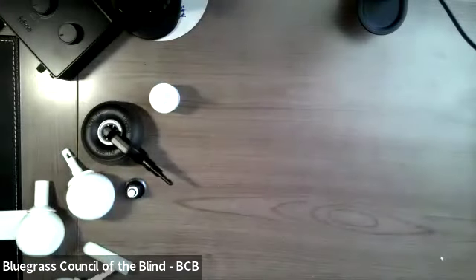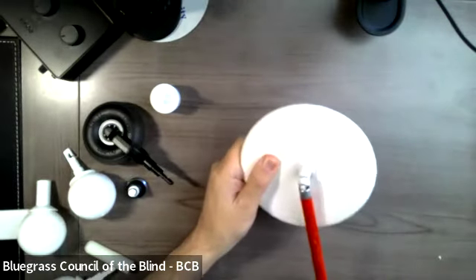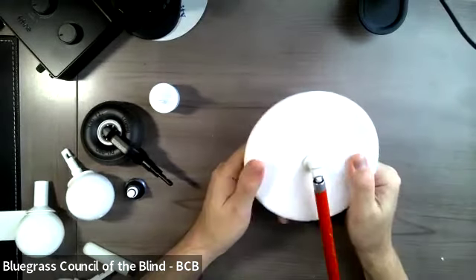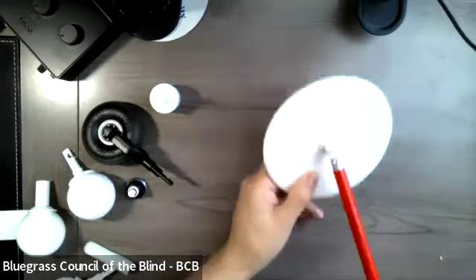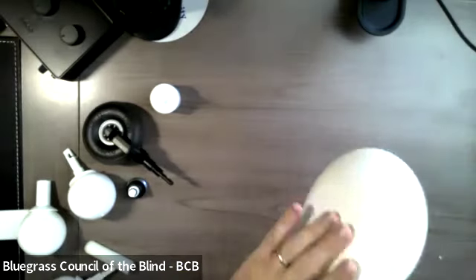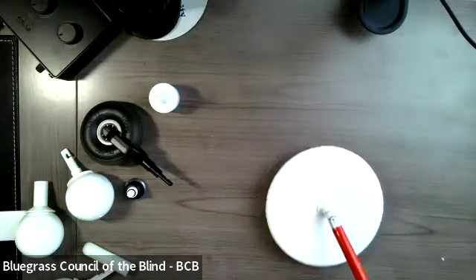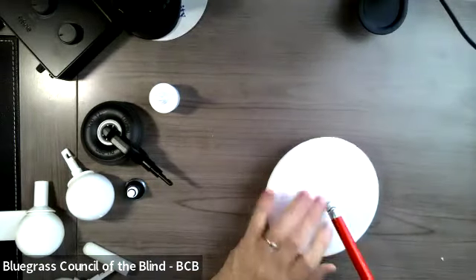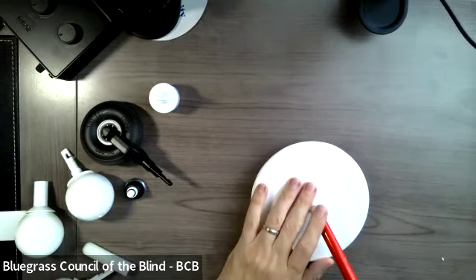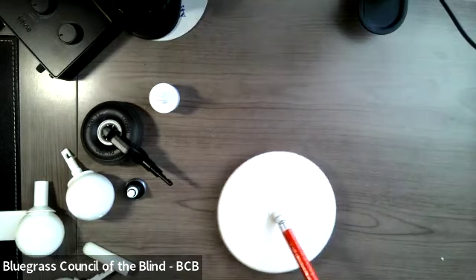Another very unique tip is the Dakota disc tip. A lot of people say this looks like a flying saucer on the end of your cane, or I've had kids say it looks like a paper plate on the end of your cane. It kind of reminds me of the metal detectors you see people using at the beach. It's flat on the top, and then it's kind of convex, I guess, on the bottom. So this glides right over lots of different material, lots of different terrain, mostly softer terrain like snow and sand and grass. It's going to be fantastic for that. Mud, anything like that your regular tip might just sink right into, this is going to glide right over it.